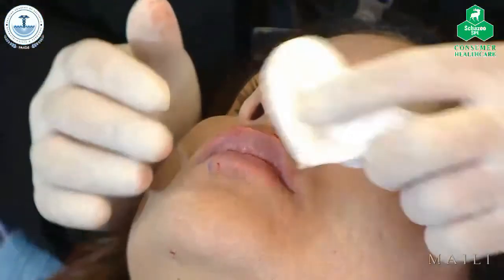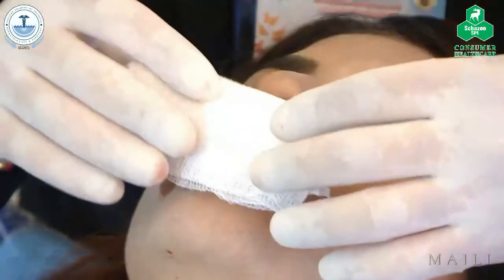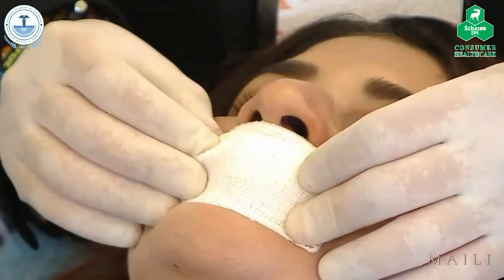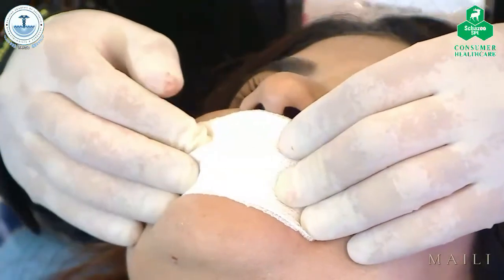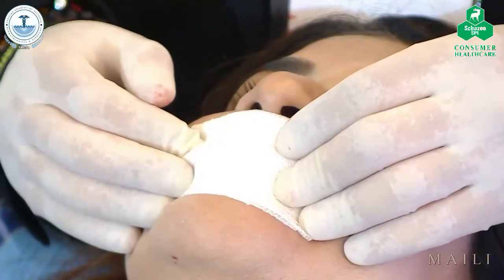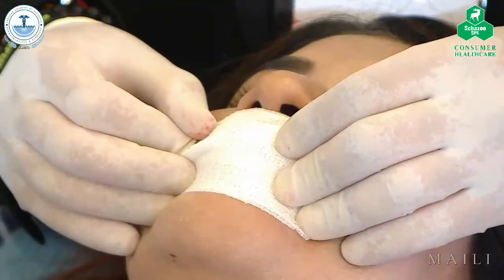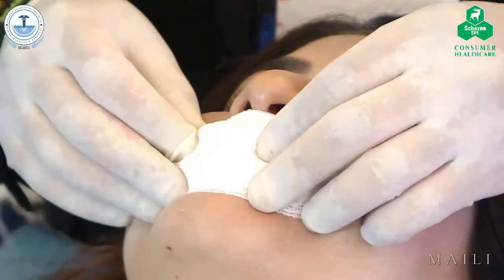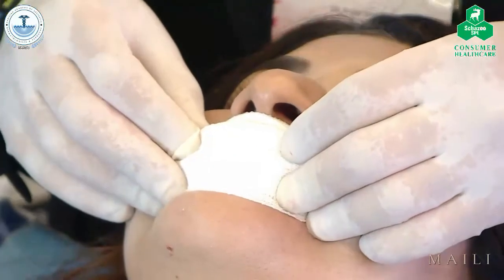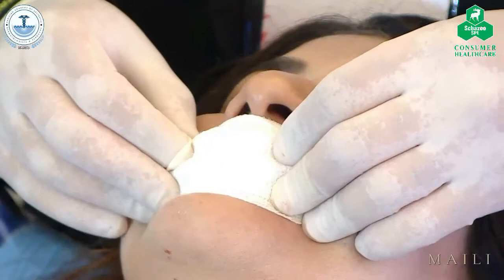Always, there's a question: how many days can you keep a filler once you have opened the syringe? There are two ways to answer this. One, you have the health authority regulatory laws. For example, in Saudi Arabia, if they come into your clinic and find an open syringe for more than 24 hours, you get fined.